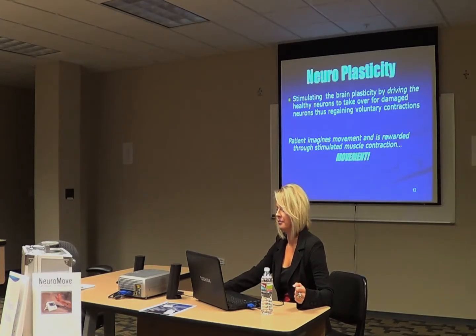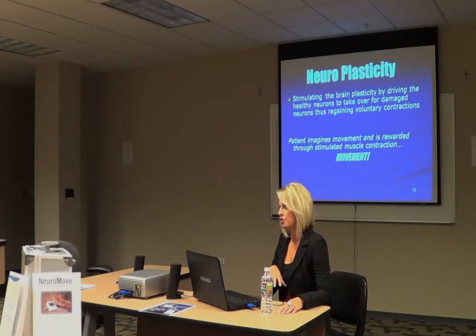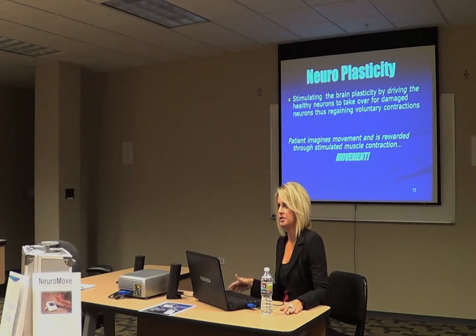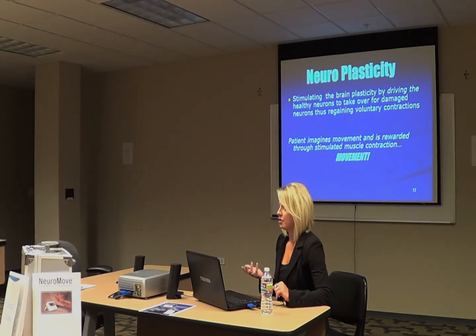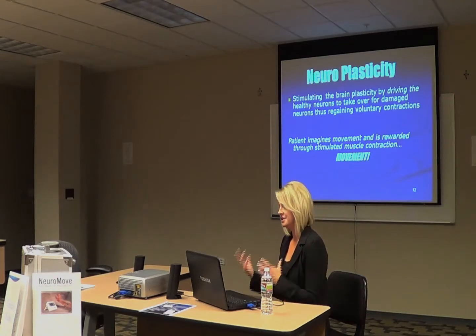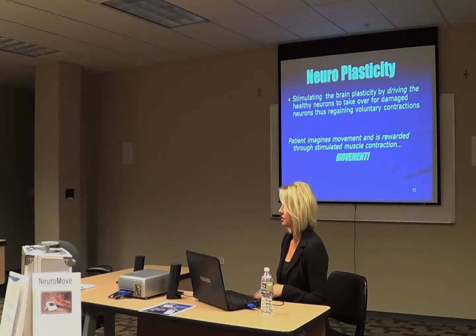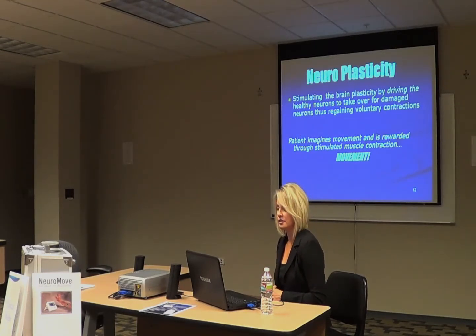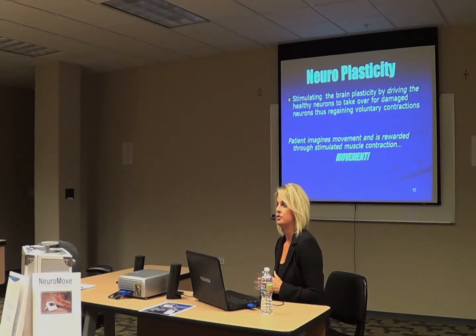Everybody here, how many of you actually do hands-on with stroke versus spinal cord injury patients? Does everybody here work with stroke patients? Yes. Pretty much, and spinal cord injury, so it's kind of a group effort? Yeah, quite a bit. Okay, so you all know what neuroplasticity is. Basically, it's taking that plasticity by driving the healthy neurons take over for the damaged neuron and regaining voluntary contractions. The patient imagines the movement and is rewarded through stimulated contraction, which equals movement.